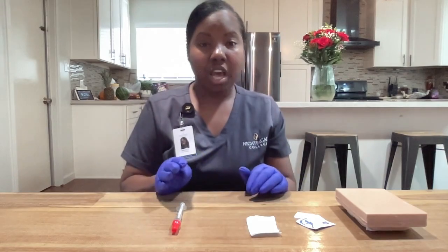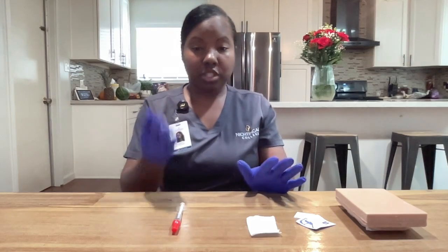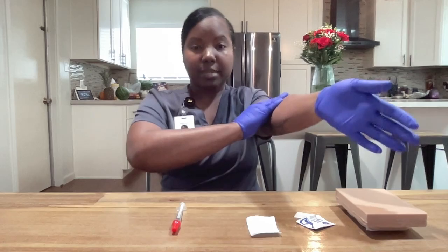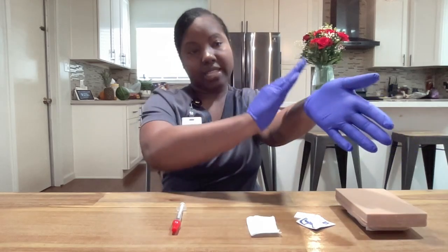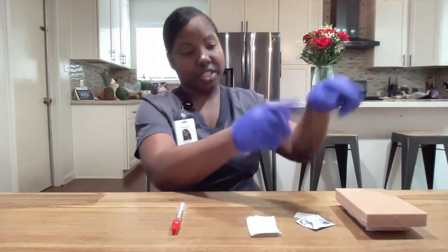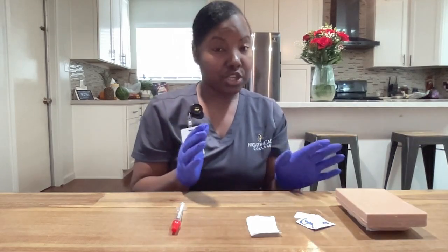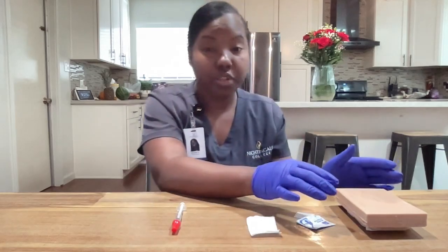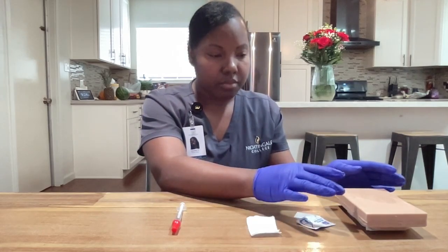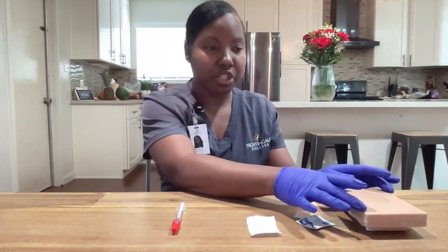I am about to assess my patient. When assessing the area you want to use, you want to measure three to four finger-widths below the antecubital space, and then a hand's width above the wrist. This area right here would be the appropriate location. You will assess your patient — check to make sure there are no lesions, no discoloration — and then palpate for tenderness. It looks like this is an appropriate spot on Mr. Jones.